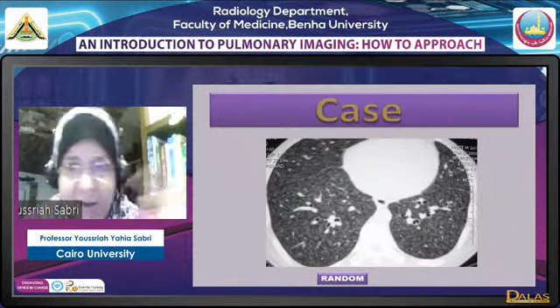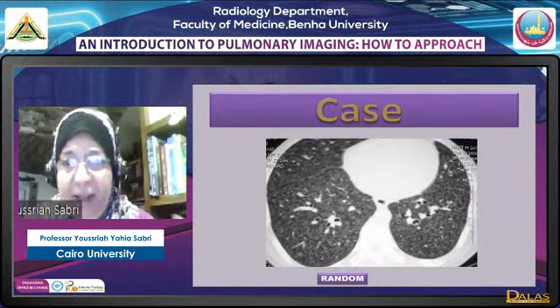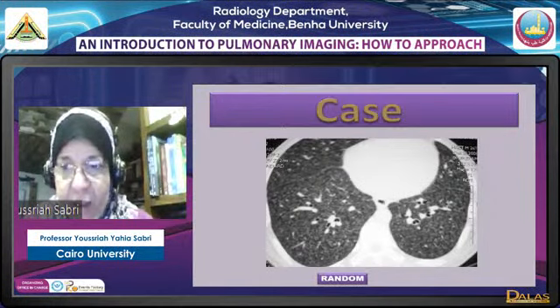The miliary pattern differential diagnosis is extremely wide, as we used to take in the third year of college. All that end with osis is miliary: sarcoidosis, tuberculosis, pneumoconiosis, etc.